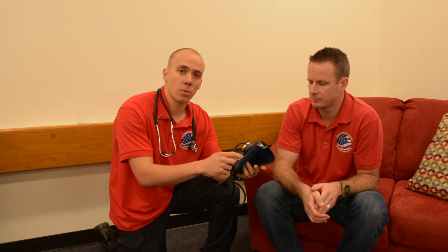One thing you need to practice, especially the first couple of times, is the finesse of letting air out. You don't want to go too fast and you don't want to go too slow. Just practice gently and very easily releasing that knob so the air gets released slowly. That takes a lot of practice, but you can practice that on yourself until you master it.